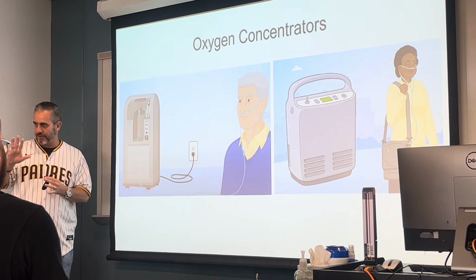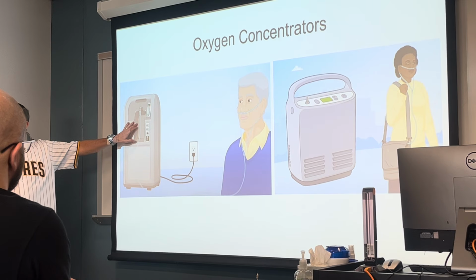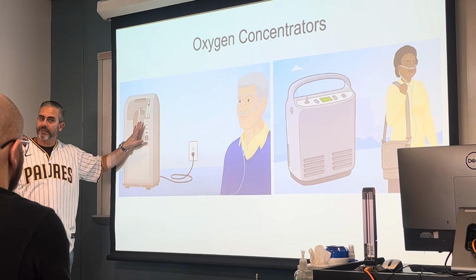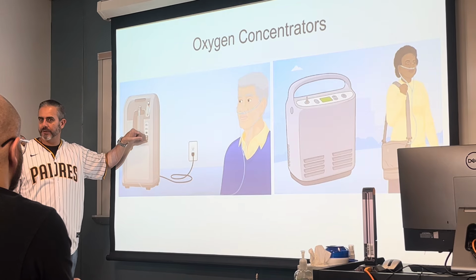Yeah, I'm not saying I agree with that all the time, but we have to be careful to let our patients know, hey, if the doctor says you need to be on 2 liters, you need to leave it alone and leave it on 2 liters. Now, some patients will think, well, 2 liters is good, 3 liters, 4 liters, 5 liters should be better, right?